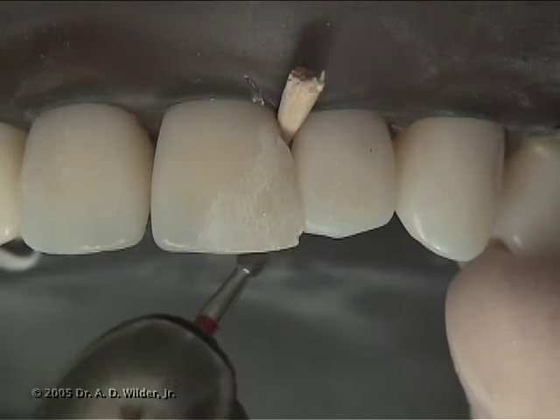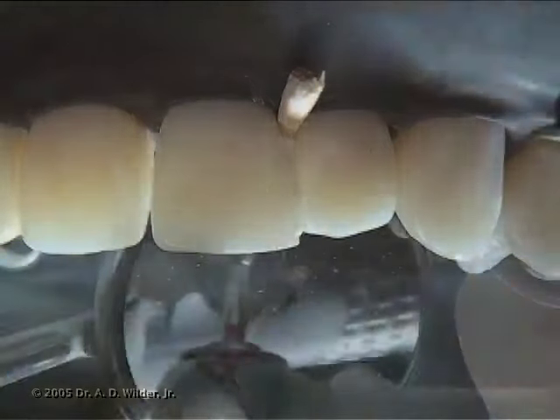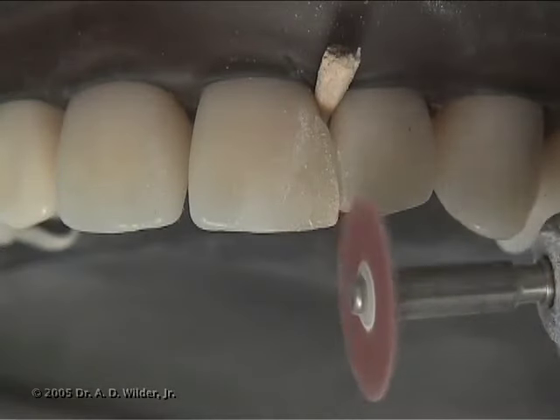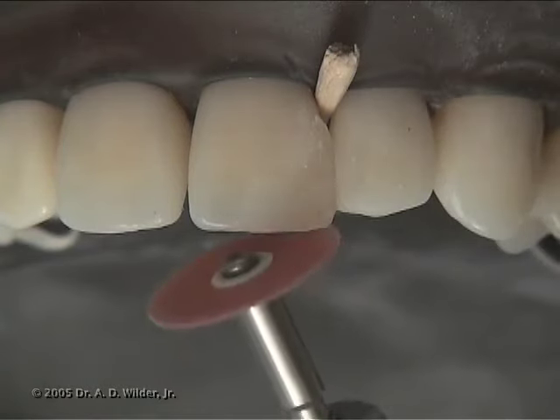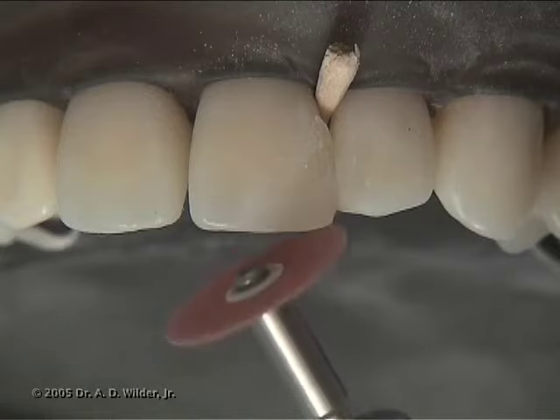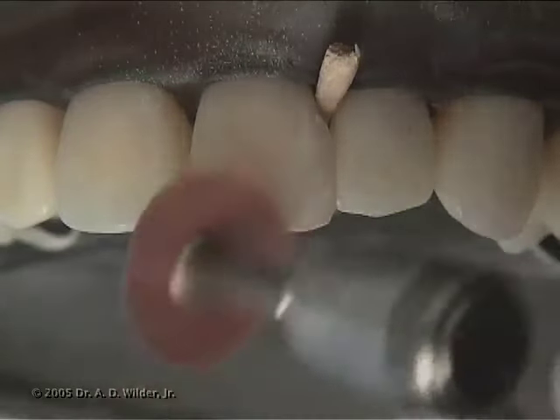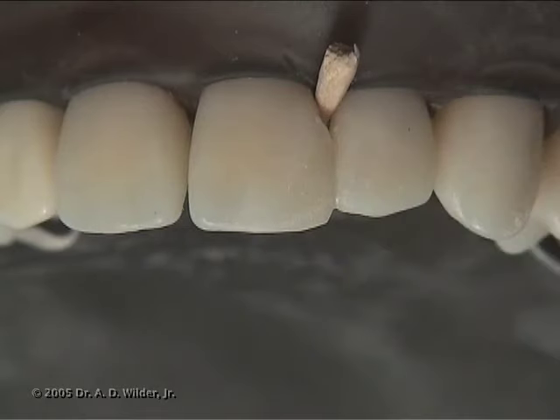You can contour the lingual aspect of the composite with a football finishing burr to recreate the natural anatomy of the tooth. Light intermittent strokes with the burr are best. Soft flex discs are also fantastic for contouring the line angles and embrasures, which are essential for an excellent aesthetic result. You can look to the contralateral tooth to get an idea of how to establish ideal anatomy. A number 12 curved scalpel blade works really well to remove any remaining flash in the embrasure areas.